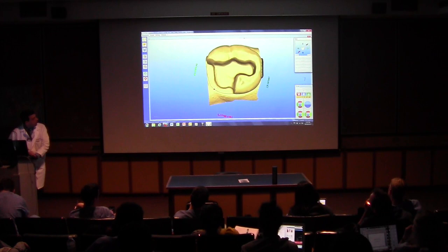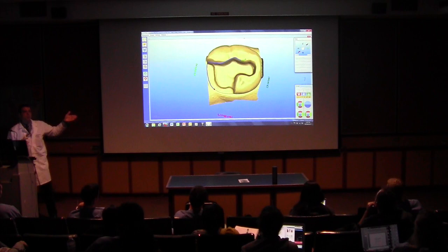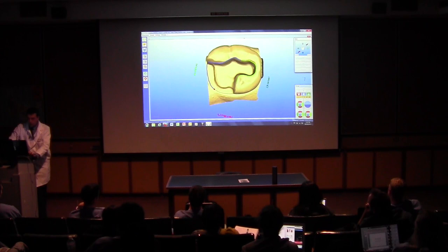The automatic margin finder is already running. Do you see a green line there? I'm not doing anything, just one finger here on my trackpad, okay? Once you do one left click, the blue line is already saved, so we can keep going to the other side of the tooth. Still just one finger working here. Because the supragingival margin is well defined, the computer can find out where the margin is.